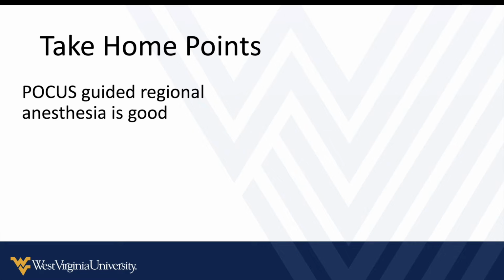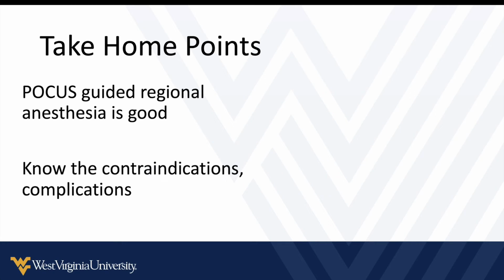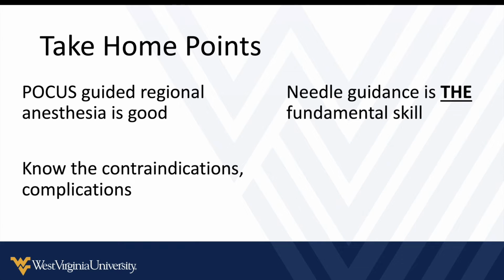We can decrease reliance on opioids, maybe not eliminate completely, but we can decrease the need for it. It's very important to understand the contraindications and the complications that may occur. Even though we're using ultrasound and doing things to minimize these, there are still things that can go wrong. And probably the most important thing is that guiding your needle is the fundamental skill.